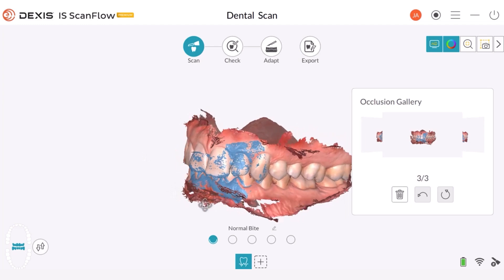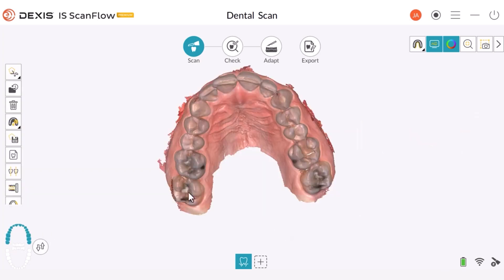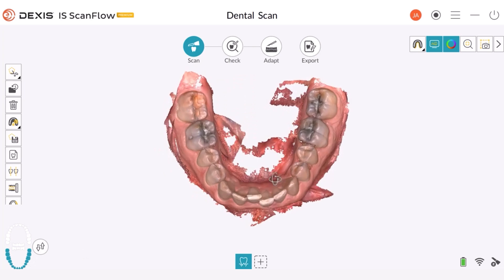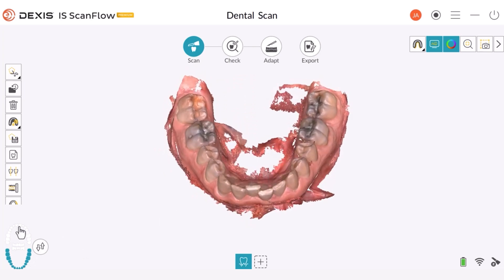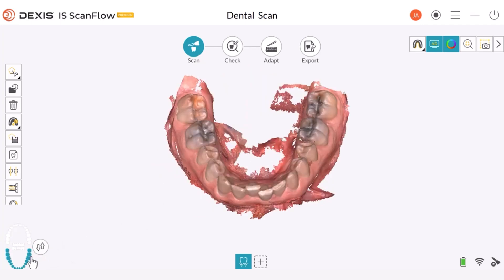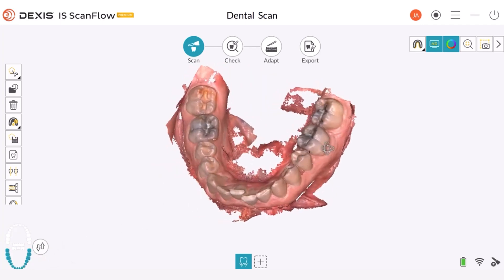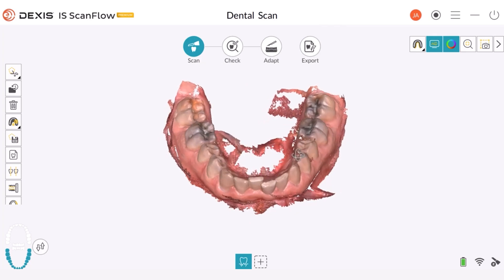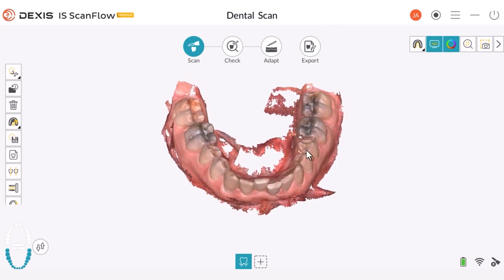I can also look at an individual arch at a time. I can change between the upper arch and the lower arch, and when I hover over these buttons, it tells me what will happen if I select them. I will now look at the upper arch and then switch back to the lower arch to evaluate them. I can see that everything here looks good — I have all the data I need to make any appliance or restoration. Once I have validated that I have all the information I need, I can simply move on.